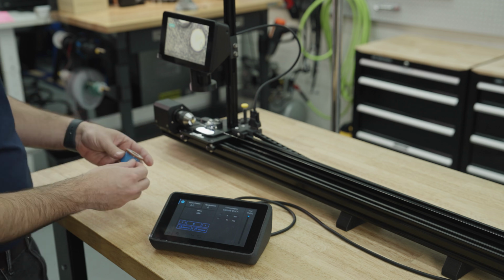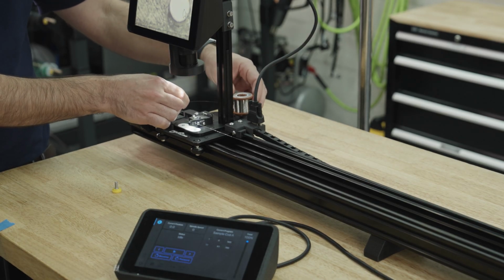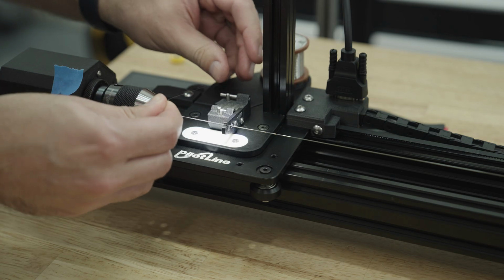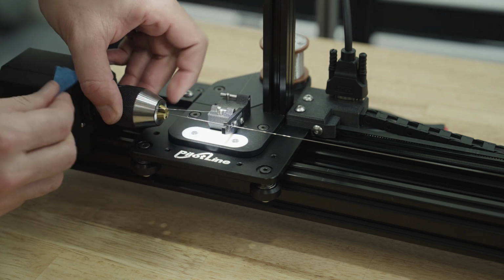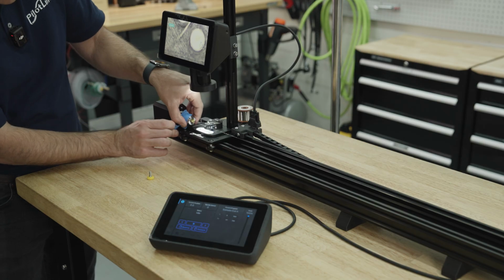Now let's thread the wire. Place the Steger bobbin on the holder and thread like so. Under the horizontal pin, over that vertical pin, and between these two. Then tape your wire to the chuck.